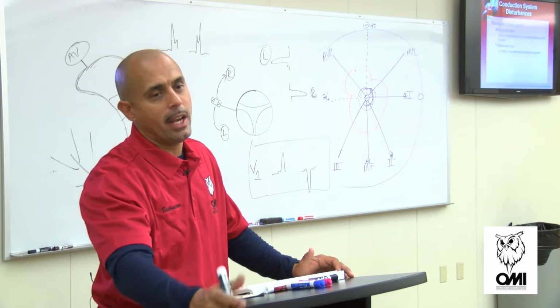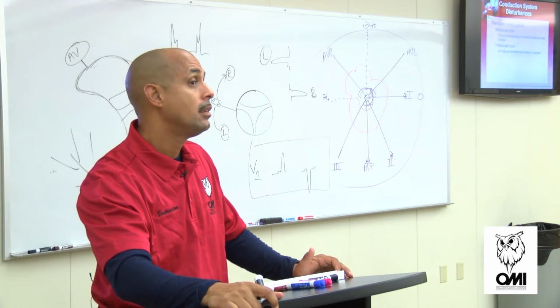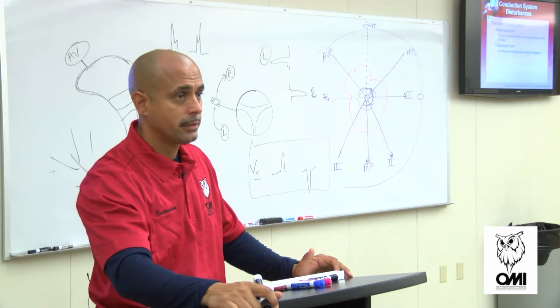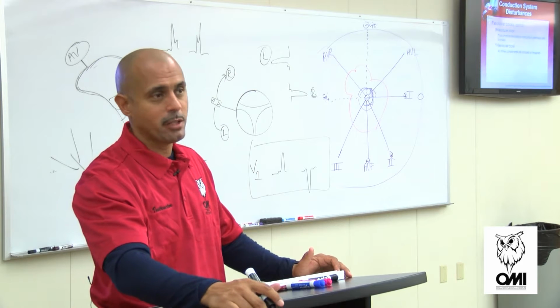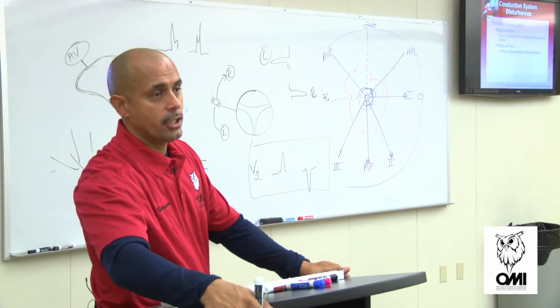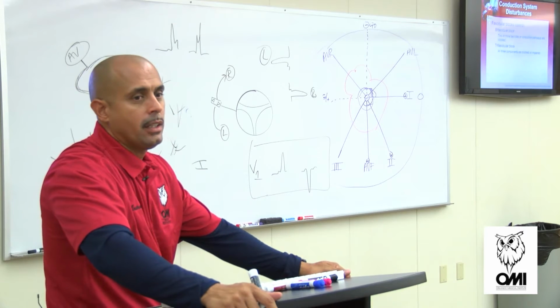If it's on the main road, it's a... It's a what? It's a complete bundle branch block. It's on the main road. It's a complete bundle branch block. So fascicular refers to the side of the road. It's talking about one of the branches. And that can only be on what side? Left. Have you seen them in your career?